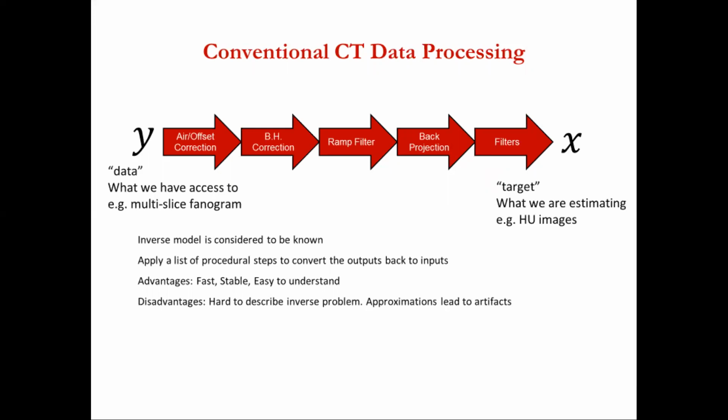Bones, the content of the materials is not included in the model. So artifacts, if you're not careful, or at least some quantitative inaccuracy, we'll get back to that. See, dual energy can be quantitatively accurate and be a principled reconstruction, whereas this analytic approach, where you approximate a polychromatic beam as being monoenergetic, can't.